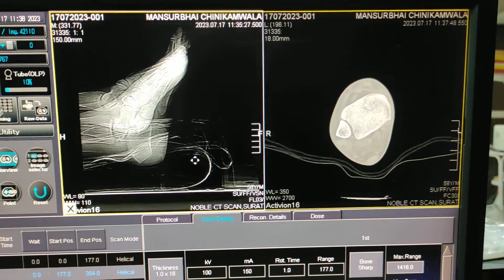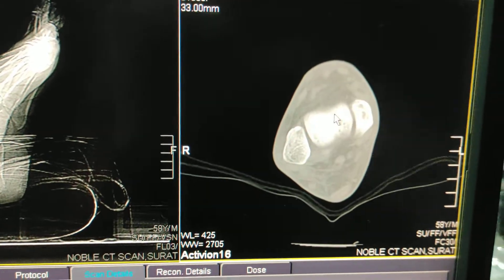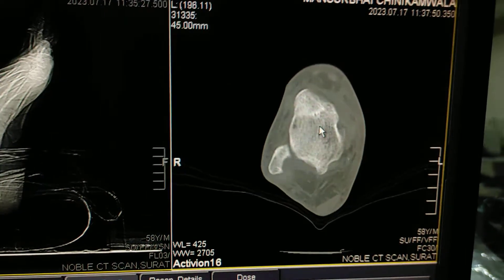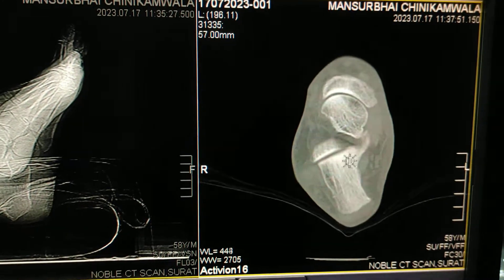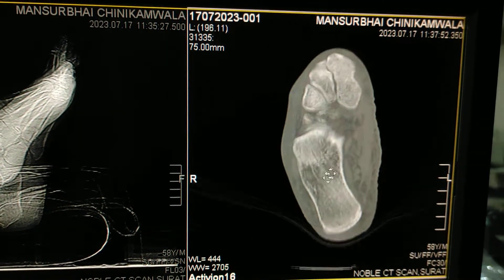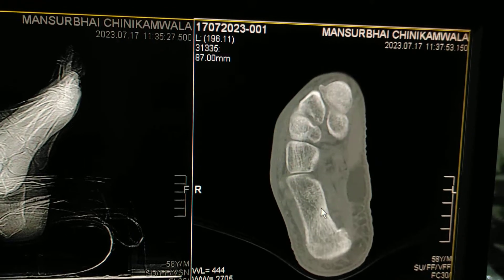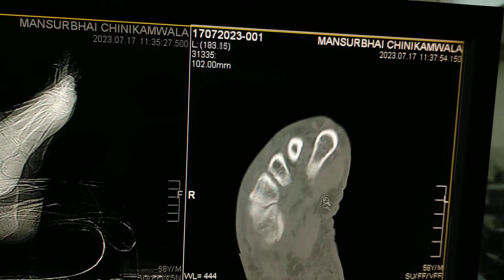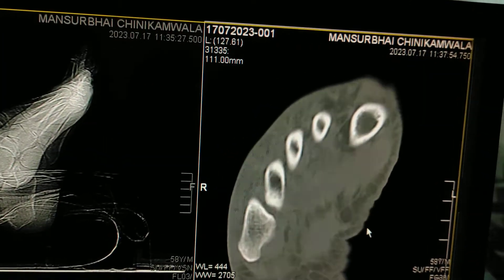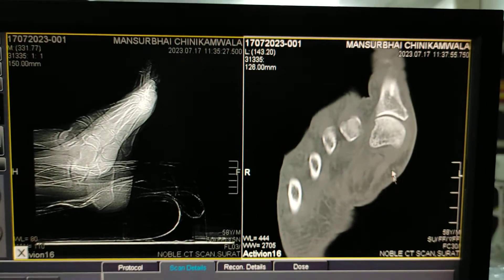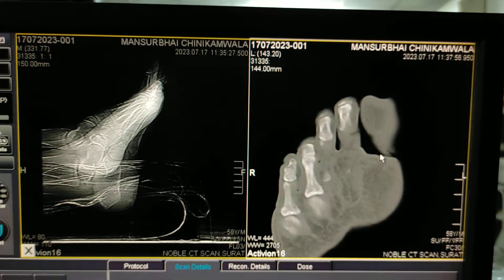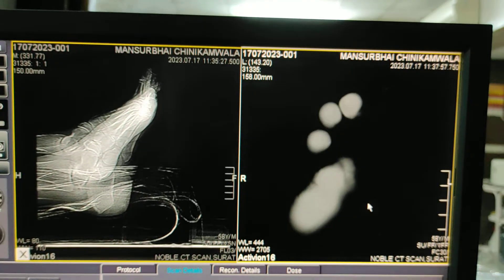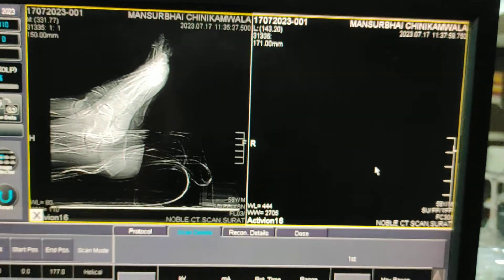It hardly takes a few minutes to complete the scan. Now I will check the images. Before you out the patient, check the images whether there is motion artifacts or not. There is the great toe to check the osteomyelitis. So images are proper.